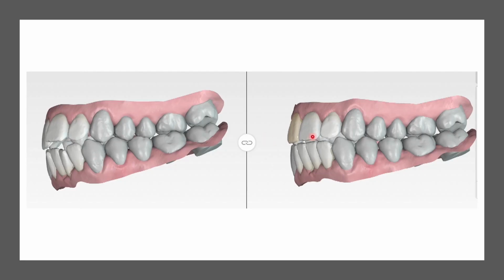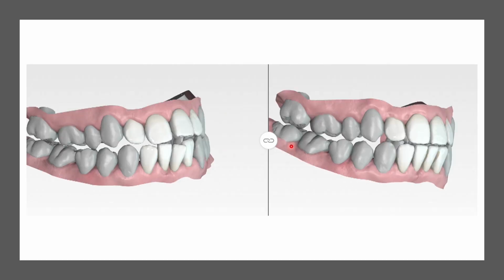We can still see that there. And so from a consent perspective, that needs to be flagged up. So when we see things that might not give us full closure on that open bite, we did flag that up at the consent and said, look, we can do some relatively straightforward moves here, but you're probably not going to get things fully together at the front there.